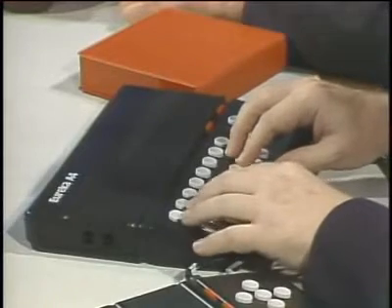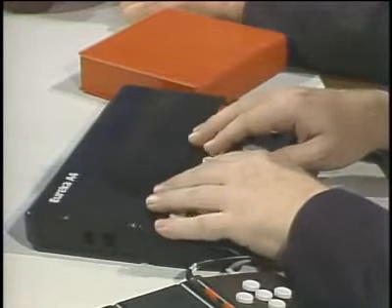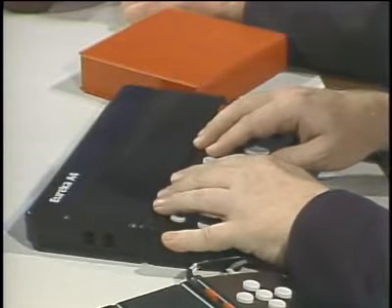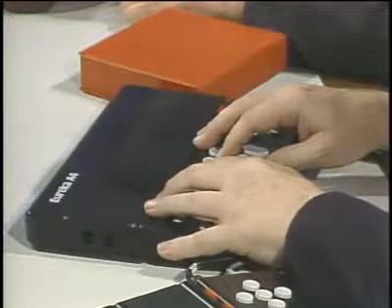Many blind people can enter in Braille notation, and Braille only has 6 dots, so we only have to have 6 keys, which means that the keyboard area here is cut down quite a bit. What are the other keys then on the keyboard? These are function keys. These get you in and out of the various programs. This is, in a way, to the IBM aficionado, sort of like DeskMate in a box. It has the same kind of memory resident programs you would expect from DeskMate. There's really no connection with that commercial product, but it's got the word processor and it's got a little database here and a phone directory.